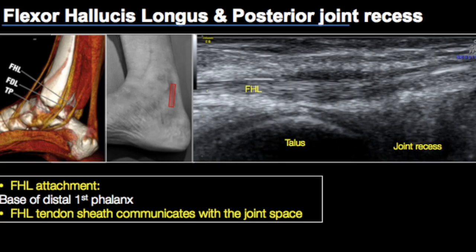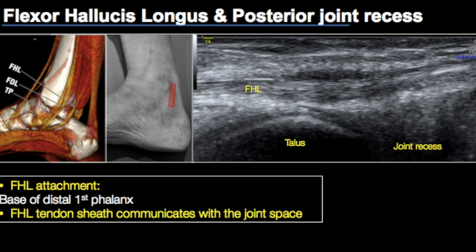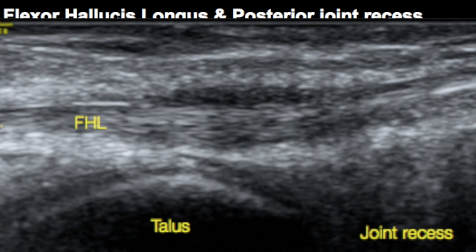The flexor hallucis longus, as it passes through the posterior aspect between the two tubercles of the talus, may show some fluid. We need to know that some amount of fluid in the flexor hallucis longus tendon sheath is a normal finding because the tendon sheath actually communicates with the joint space. Hence, before calling fluid within the FHL tendon sheath tenosynovitis, make sure it is not actually an anatomical variant.